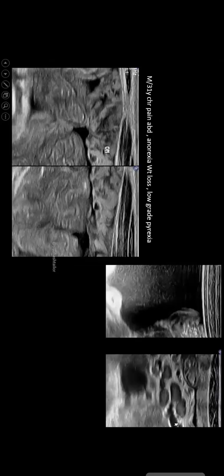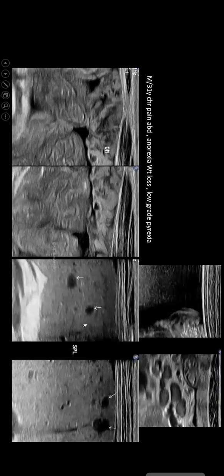Ascites with low-level internal echoes, nodes, mesenteric nodes. But importantly, the spleen is showing multiple hypoechoic foci of variable size. The same patient. So these small lesions are granulomas. These are microabscesses. So basically, this is a case of TB abdomen involving TB peritonitis and ascites, lymphadenitis, and visceral involvement, spleen showing granulomas and microabscesses. And this is how we complete our diagnosis.